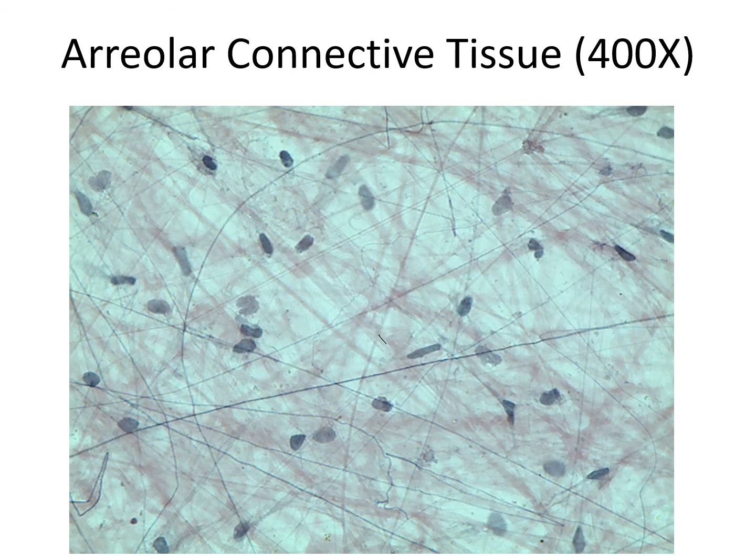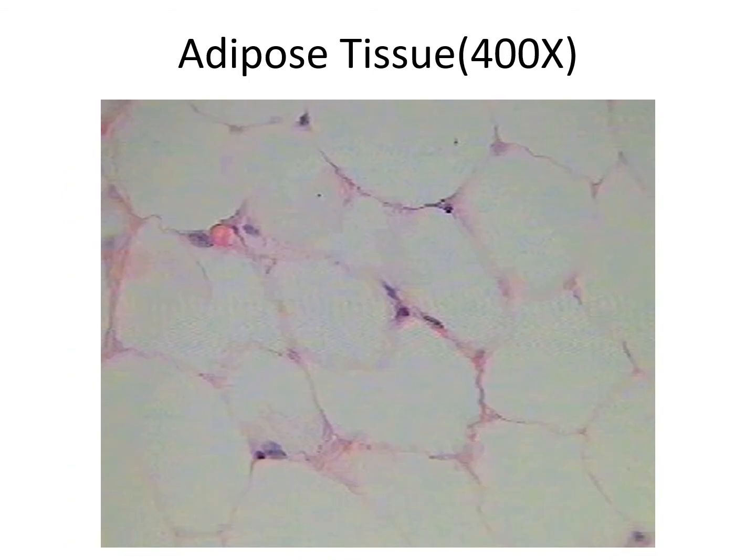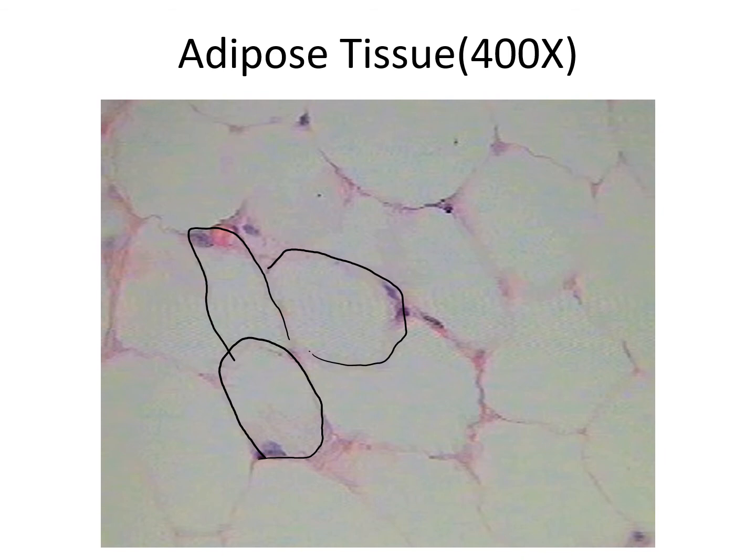Right. Next one, adipose tissue. Well, adipose tissue is connective tissue proper, and it's also loose. So over here you see, let's say, this one, that one, an adipocyte. Here probably another adipocyte. Here's another one. Inside we have a huge vacuole that is filled with fat, and here's the nucleus, a little bit of cytoplasm here and there, but that's adipose tissue.